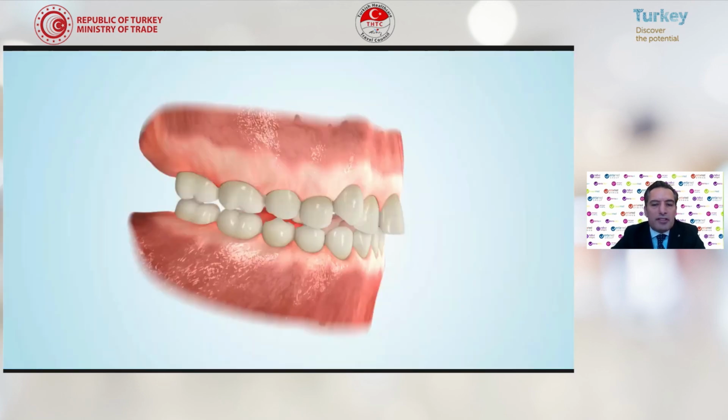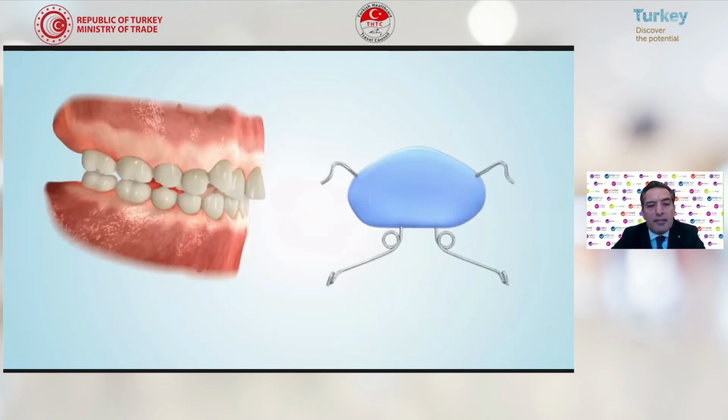Molar distalization. In some cases, we need to move the molars a little bit more to the distal area because there is not enough space in the anterior region. We need to move the crowns a little bit backwards.